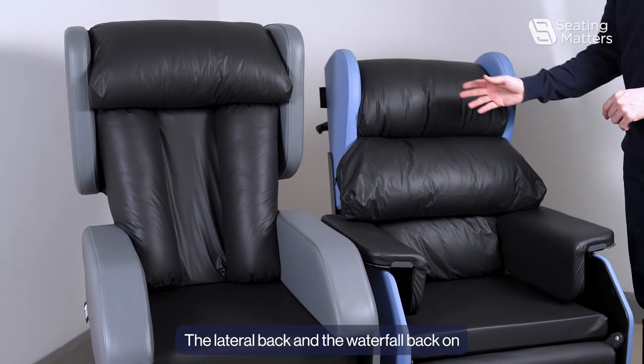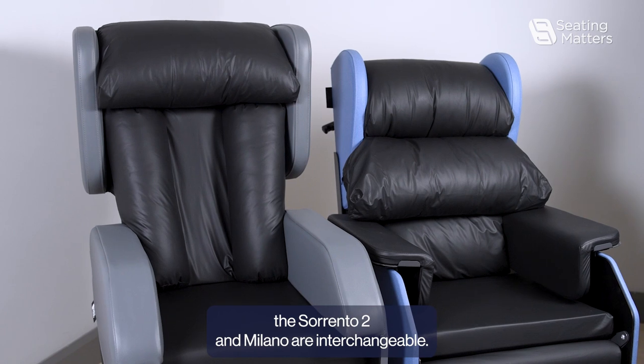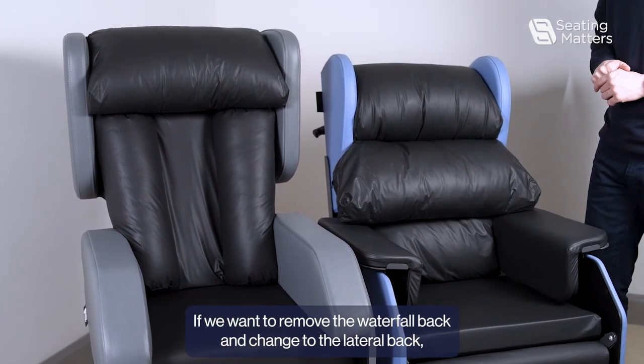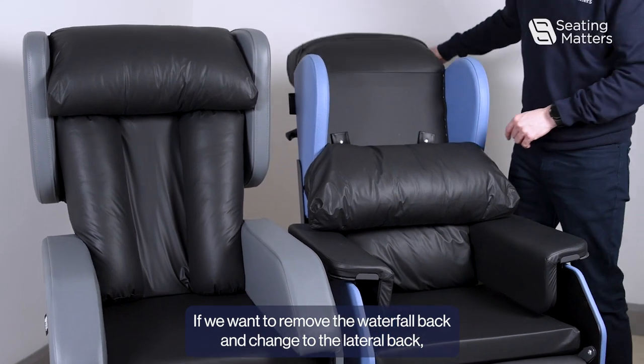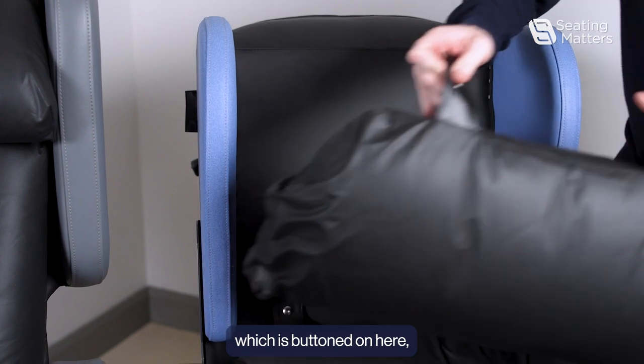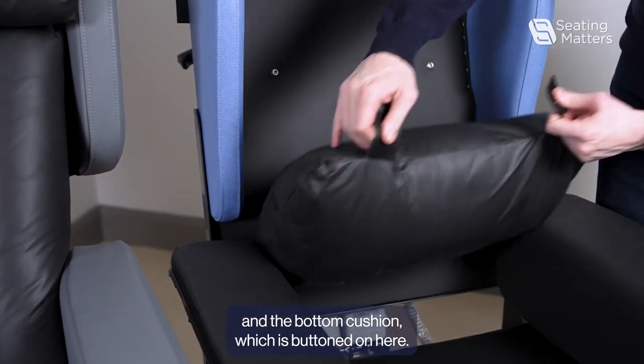The lateral back and the waterfall back on the Sorrento 2 and Milano are interchangeable. If we want to remove the waterfall back and change to a lateral back, we just remove the middle cushion, which is buttoned on here, and the bottom cushion, which is buttoned on here.